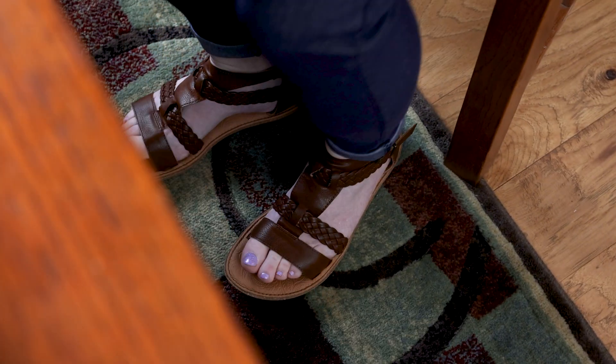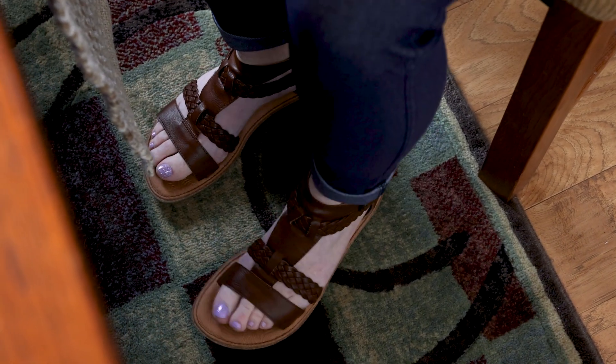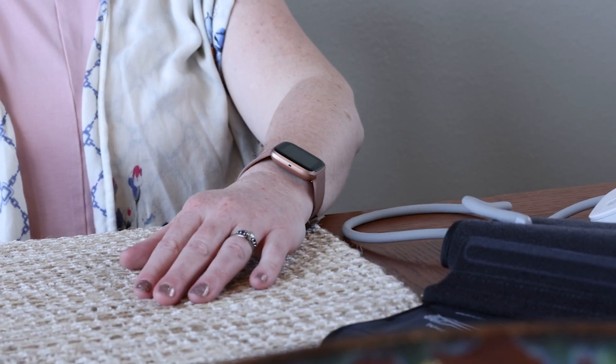Step 1, keep your legs uncrossed while sitting and place your feet flat on the floor. Step 2, rest your arm on the table so it is at heart level.